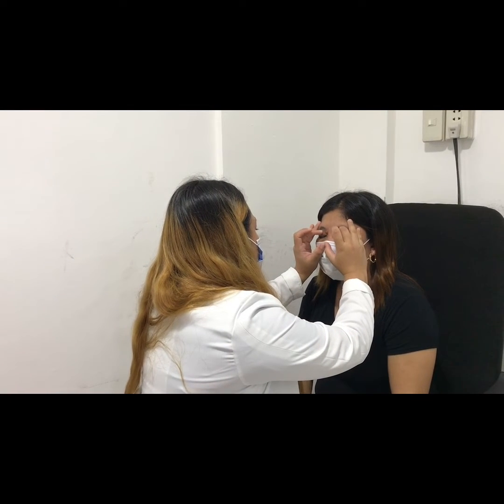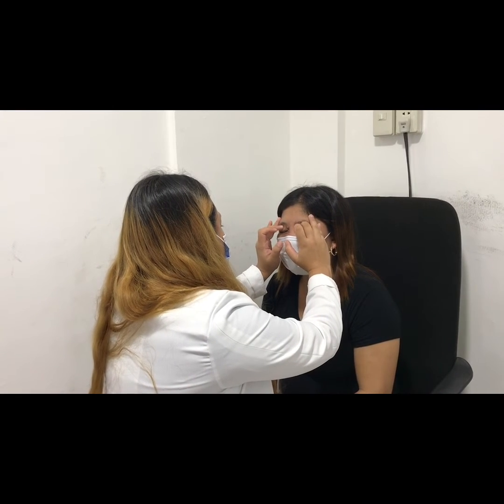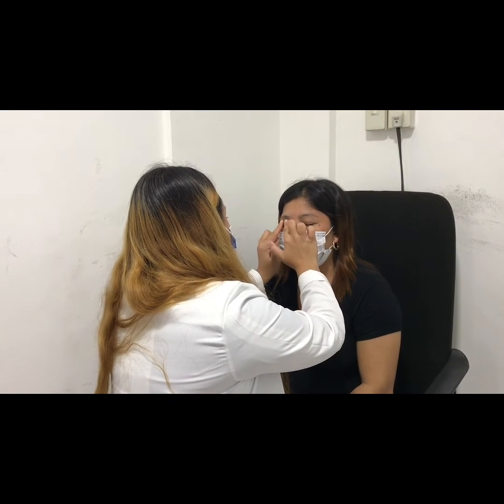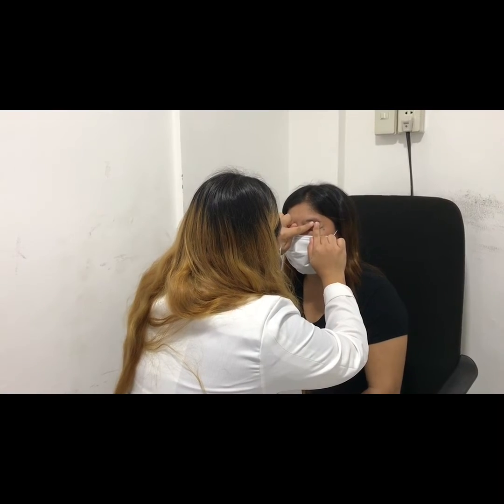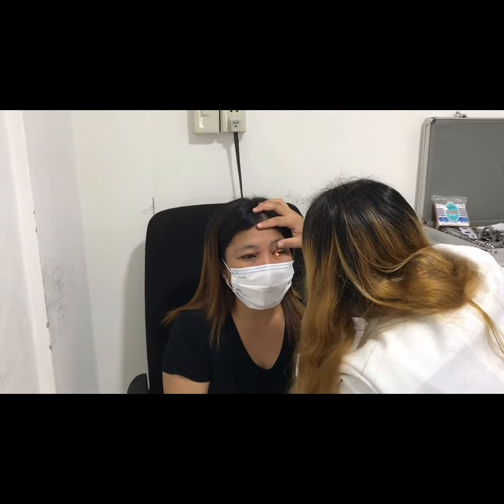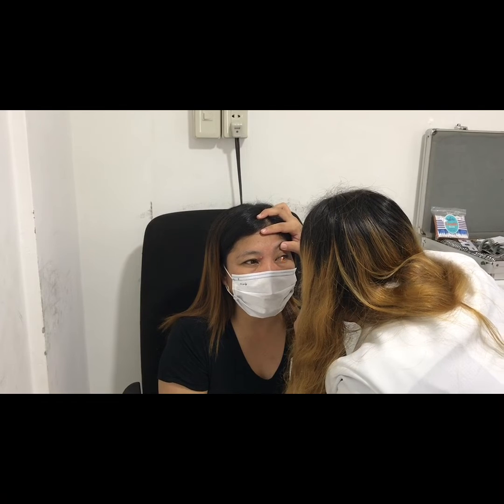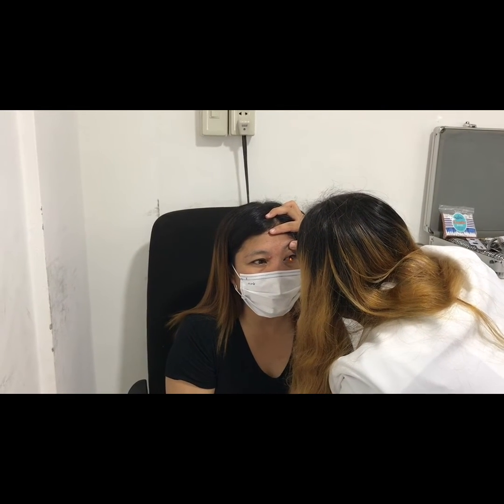As you can see, I'm pressing her eyeball, nose tip, and forehead from time to time to compare the hardness of her eyeball to her nose tip and forehead. Number 8, ophthalmoscopy. I did the direct ophthalmoscopy to check the status of her fundus as well as her red-orange reflex and fovea reflex.